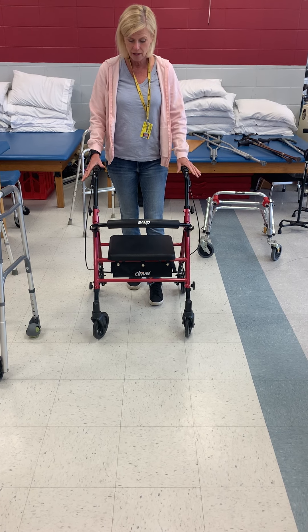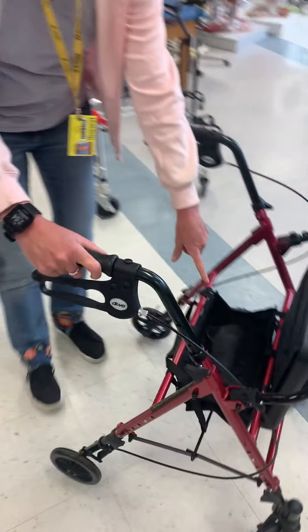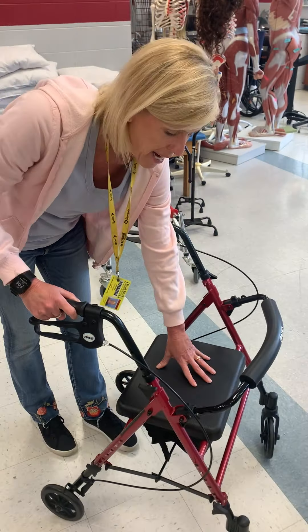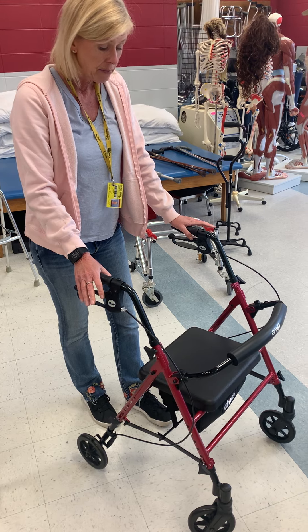The good thing about rollators is that they have a bench. Patients can put items inside the bench so they can carry things around the house. Sometimes I'll have patients put their plate from the kitchen on it and carry it to the living room. They can also sit on it.